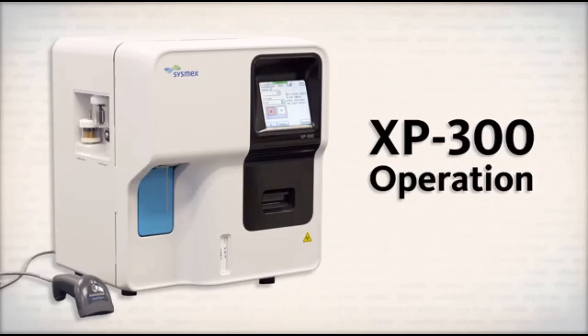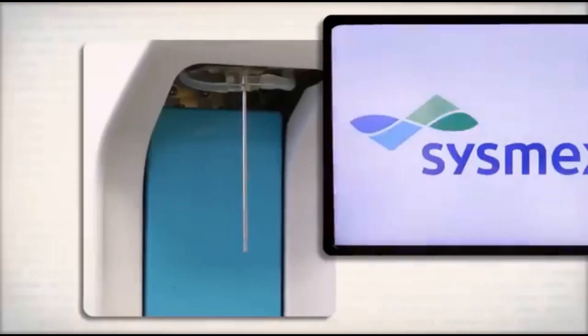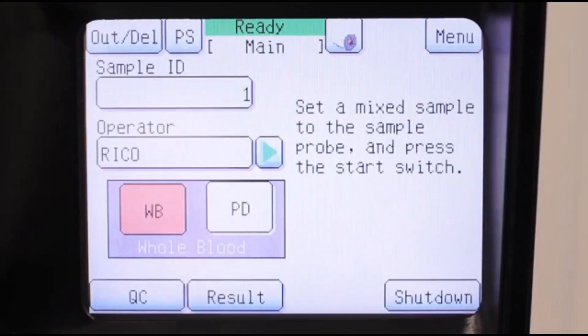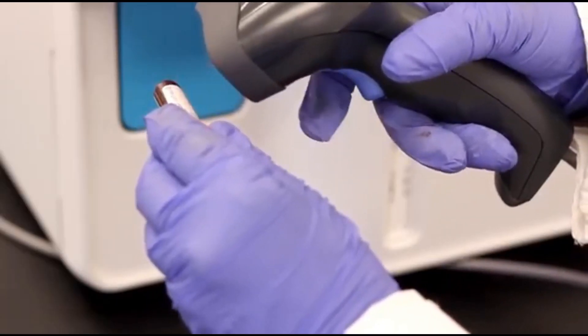The XP300 is simple to operate. To begin, turn on the analyzer. The XP300 will automatically go through its startup sequence. To run a patient sample, check to make sure the analyzer is in the ready state. Enter the sample ID using the barcode scanner or touchscreen.